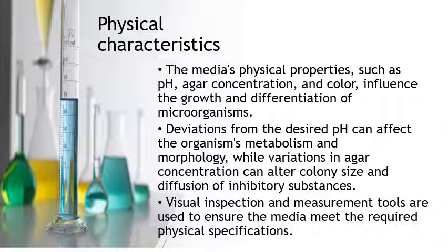Then the physical characteristics of the agar, which include the pH, the acidity and alkaline nature of the agar, the concentration of the agar, which can determine the thickness of the agar, the color content, which can be a color indicator that gives the agar medium a particular reaction based on microorganism fermentation or pigment production, has direct influence in differentiating several microorganisms during cultivation.